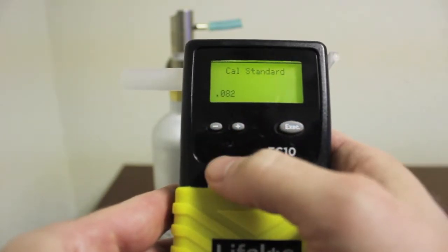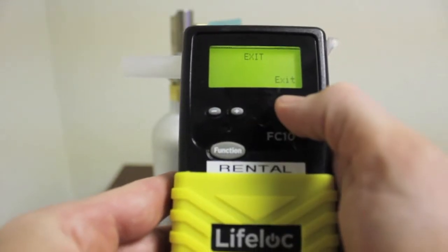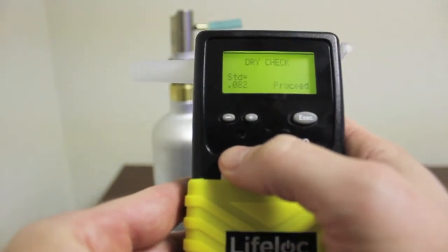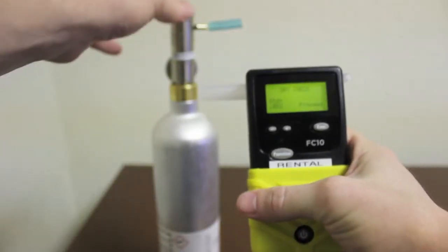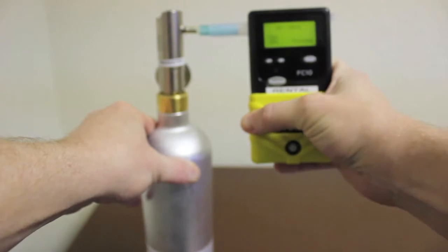Press the function button until you reach the exit screen, then press the execute button to reach the cal settings screen. Press the function button until you reach the dry check screen. Connect your breathalyzer to the dry gas tank by sliding the mouthpiece over the blue tubing.